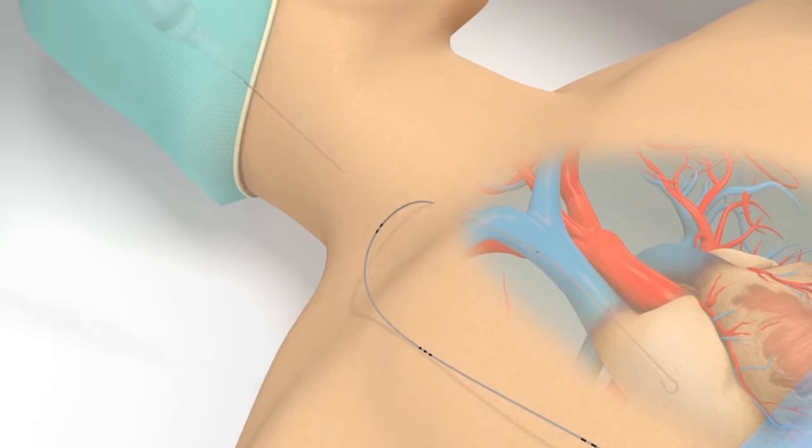Utilizing a number 11 blade scalpel, make a 1/2 to 1 centimeter incision adjacent to the guide wire at the venotomy site. This creates the insertion site and prevents the formation of a dermal bridge, which may snag or inhibit passage of the catheter during insertion.